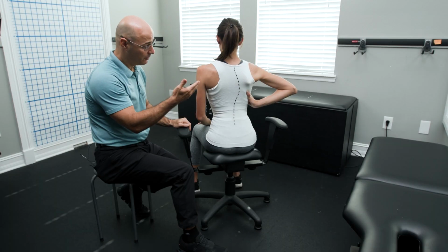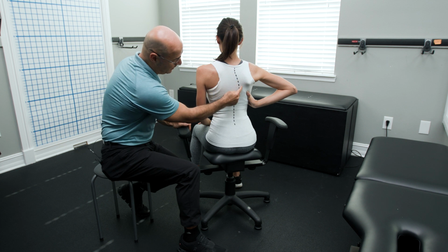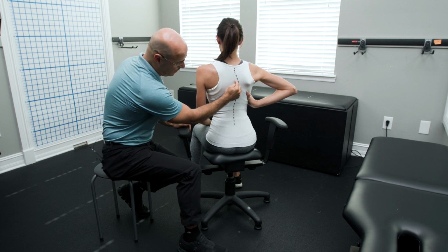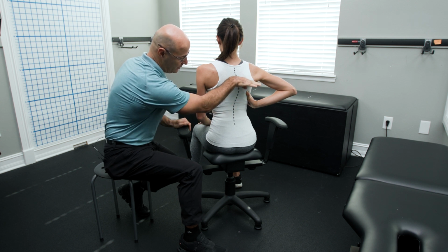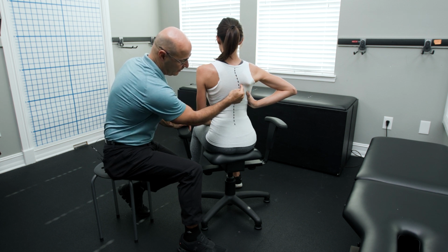So we want to demonstrate one for the thoracic curve, and you see her curve is up here in the thoracic, so she's using her hand to pivot off the ribs. Now remember that ribs are angled, so they don't go straight out, so we want to go off the ribs, so that's why her hand's a little bit below the apex.